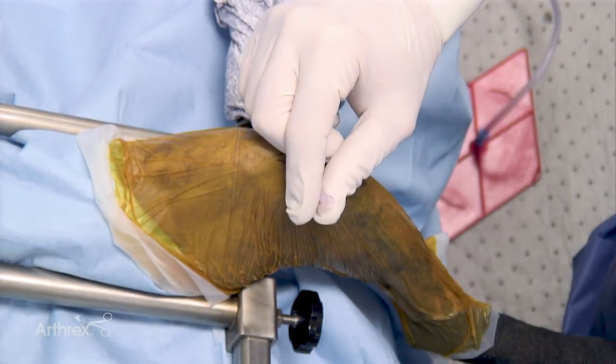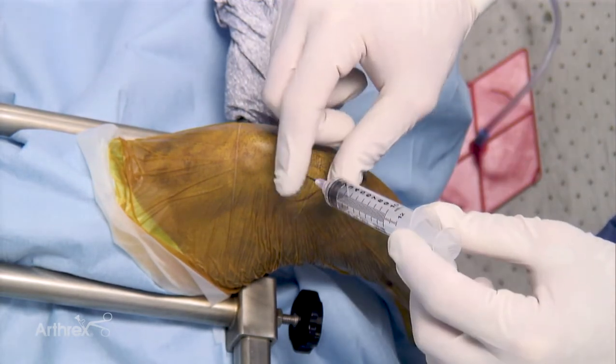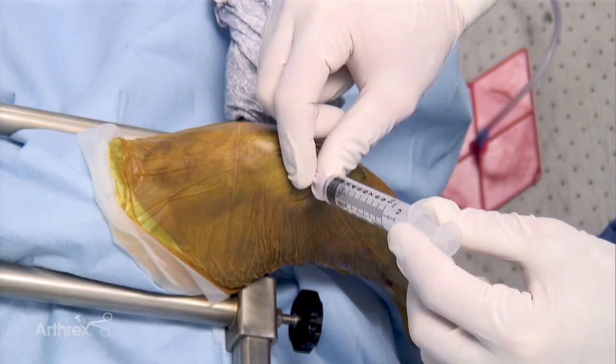Following joint fluid collection, distention of the joint is possible. Some surgeons prefer not to distend the joint and make the ports immediately. This is a matter of personal preference.